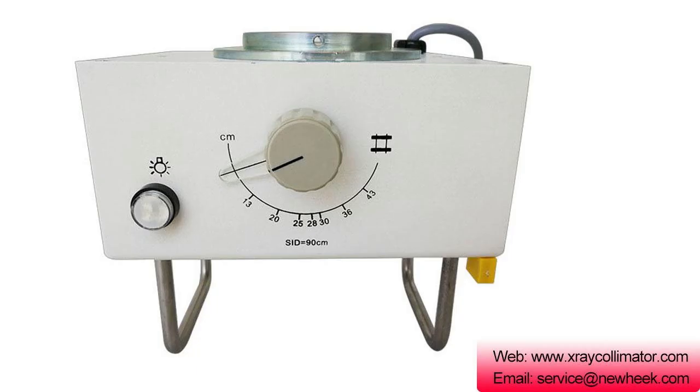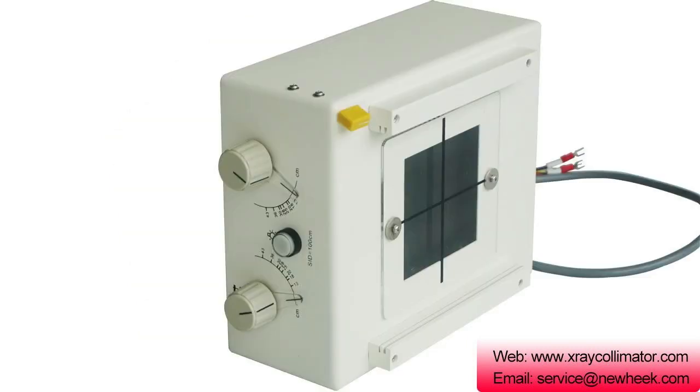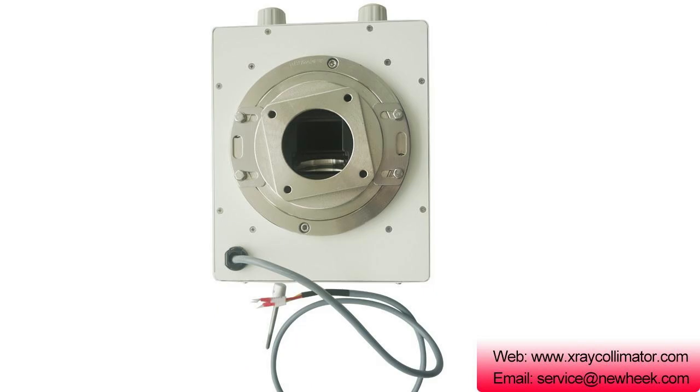The X-ray collimator is an electromechanical optical device mounted in front of the X-ray tube assembly sleeve output window. Its main function is to control the illumination field of the X-ray tube output line, in order to meet X-ray imaging and diagnosis requirements, reduce X-ray scattering, and avoid unnecessary doses.